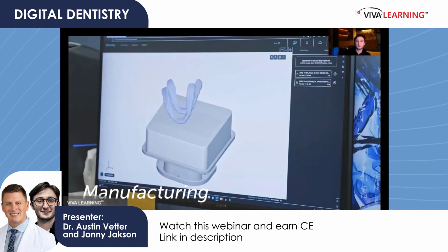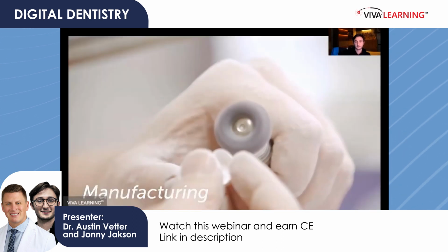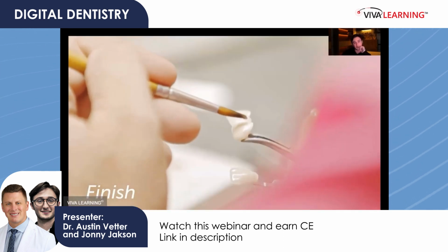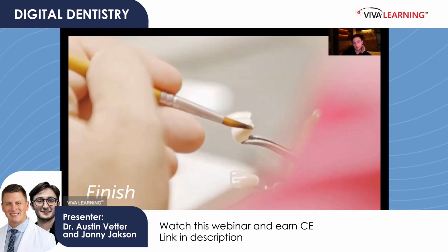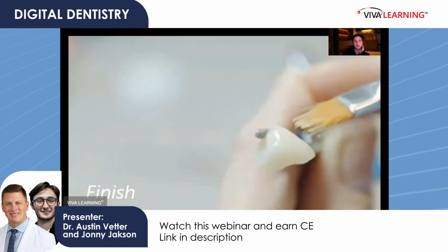And also, you've got your 3D printing, right? So you've got either milling or 3D printing as far as manufacturing. A lot of restorations are monolithic zirconia type restorations, right? You're milling monolithic zirconia or monolithic Emax.